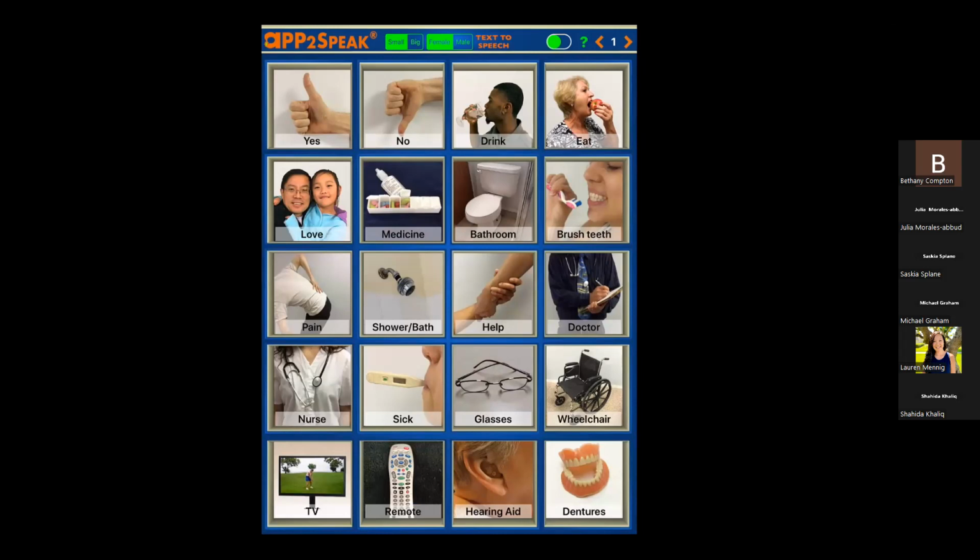The modifications on the preset pages: you can turn the photos on or off, and you can rearrange them. These photos are not in any particular order. So the preference of the user, they can move them, they can also turn them off.